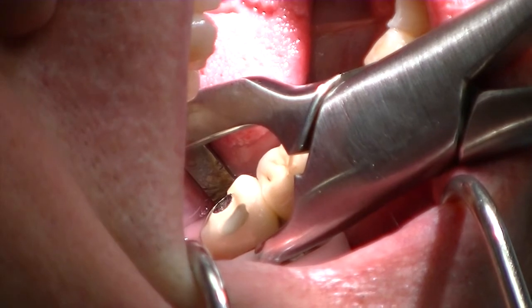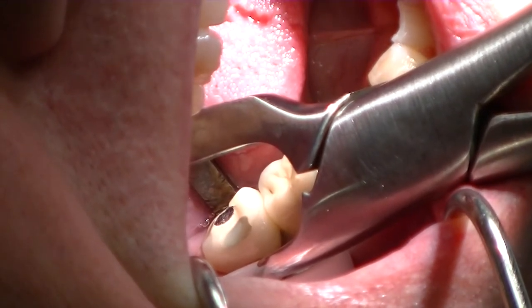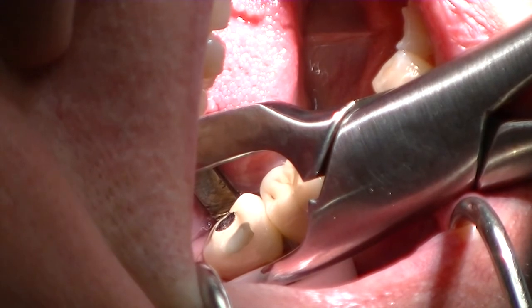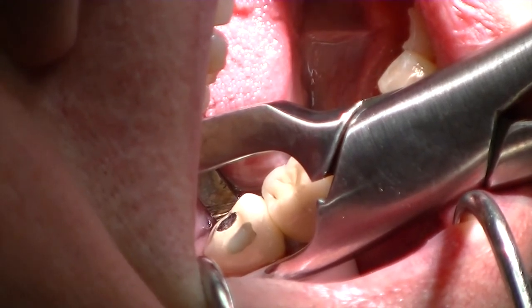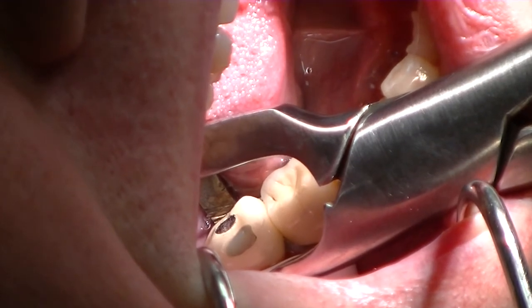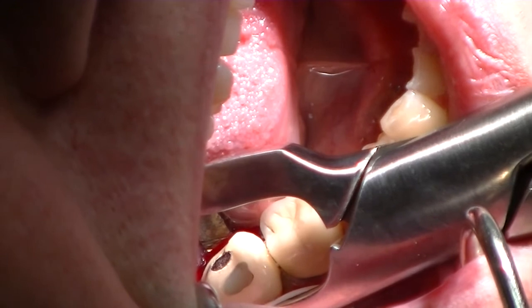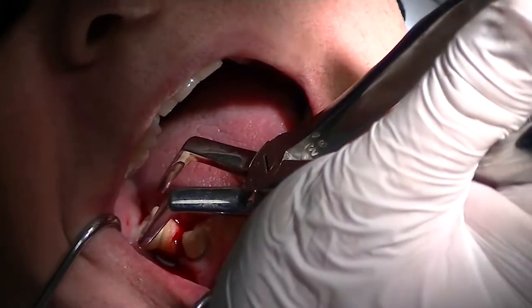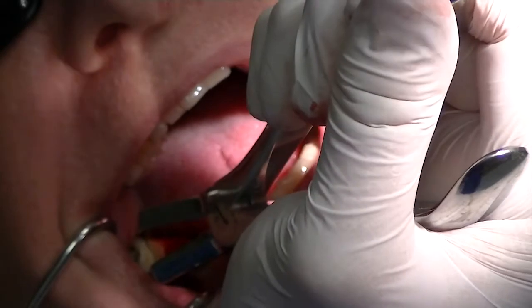So we're engaging the beak onto the lingual surface of the tooth, and you can see how nicely the instrument fits into the shallow vestibule. I'm simply rotating my wrist, not squeezing like you would a normal forcep. It may take a minute or two, so you have to be patient with this instrument. Okay, I got it. Do you see the tooth move a little bit? We're engaging it, moving a little bit. The tooth kind of jumped out of the socket, and we'll use our little instrument to grab onto it and simply rotate it back out of the socket.